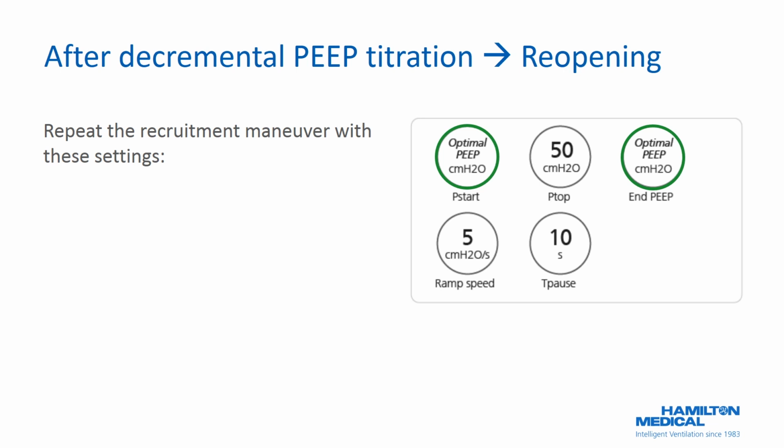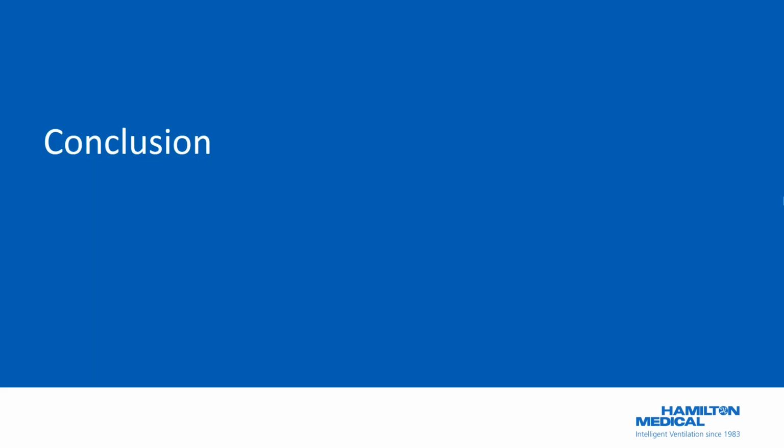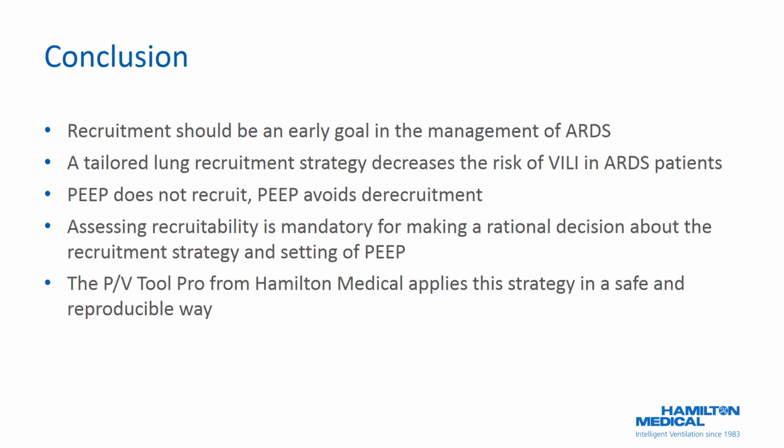Now it is time to conclude. Recruitment should be an early goal in the management of ARDS. A tailored lung recruitment strategy decreases the risk of ventilator-induced lung injury in ARDS patients. PEEP does not recruit. PEEP avoids de-recruitment. Assessing recruitability is mandatory for making a rational decision about the recruitment strategy and setting of PEEP.